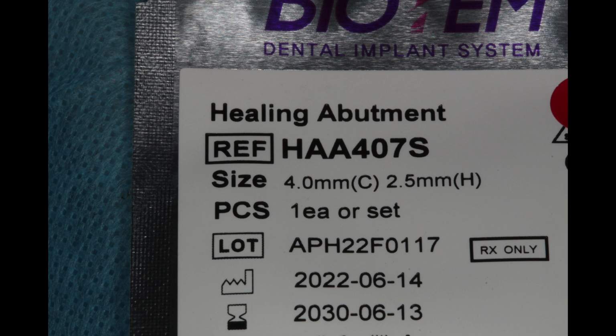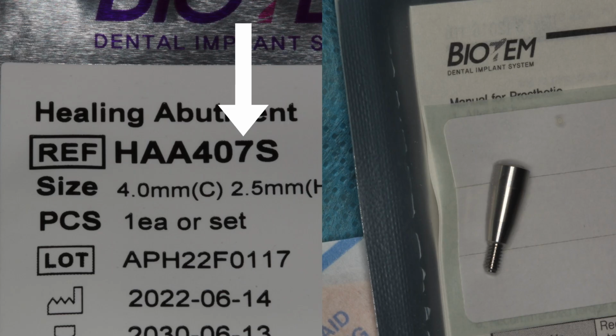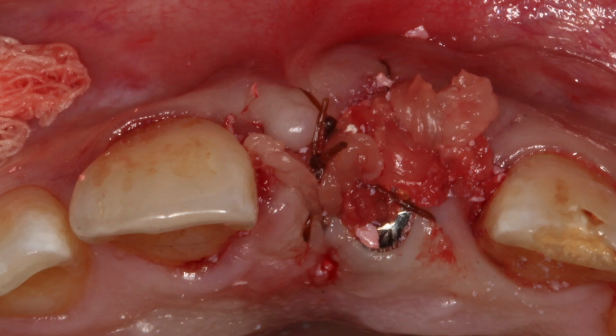In my practice, I would routinely do cases like this with what we call the non-occluding implant restoration, basically a resin provisional screw retained that is out of occlusion and out of contact. However, due to the circumstances, we used a healing abutment, and we chose a long healing abutment for this purpose. I think there's something wrong with this image here because this is a 7 millimeter healing abutment, but the label says 2.5 height. It doesn't make any sense to me, but anyway, we chose this 7 millimeter very long healing abutment because we really wanted a tissue to get not submerged.